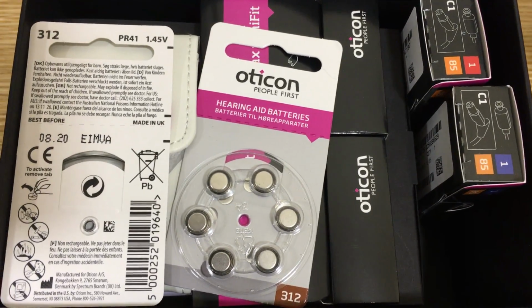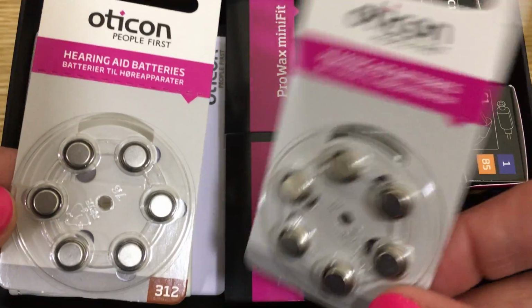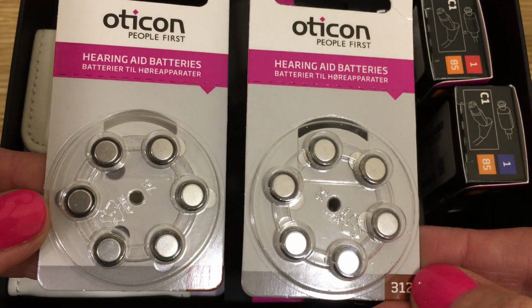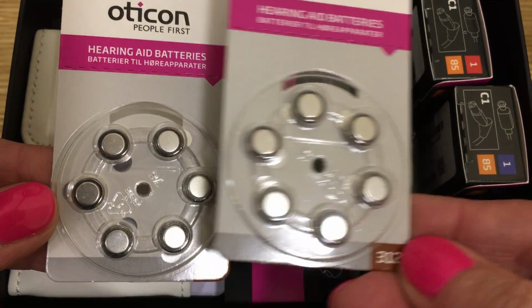Next, inside we have the batteries. This model uses the size 312 batteries, and you can see the size at the bottom right hand corner. Generally, size 312 batteries are coded in brown.